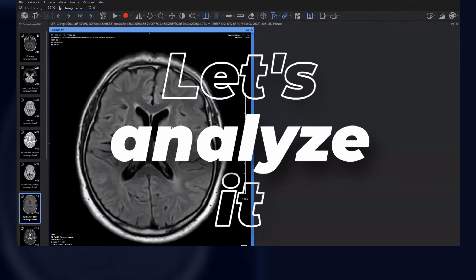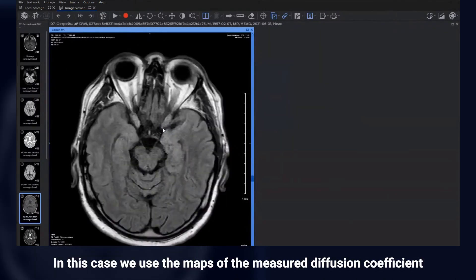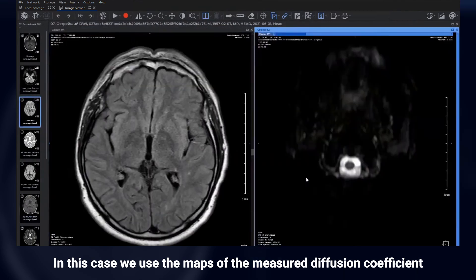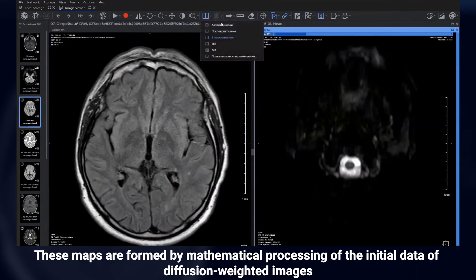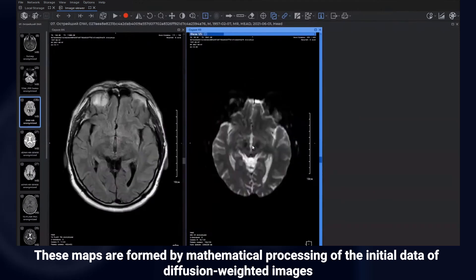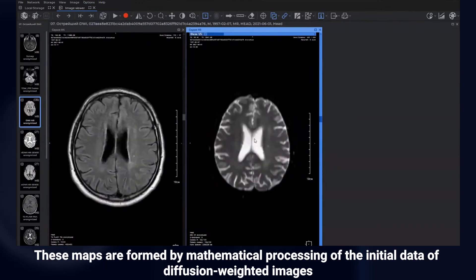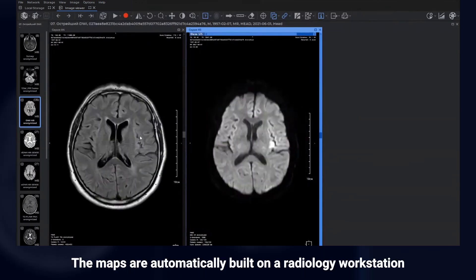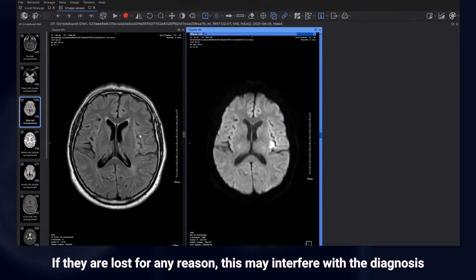Let's analyze it. In this case, we use the maps of the measured diffusion coefficient. These maps are formed by mathematical processing of the initial data of diffusion-weighted images. The maps are automatically built on a radiology workstation. If they are lost for any reason, this may interfere with the diagnosis.